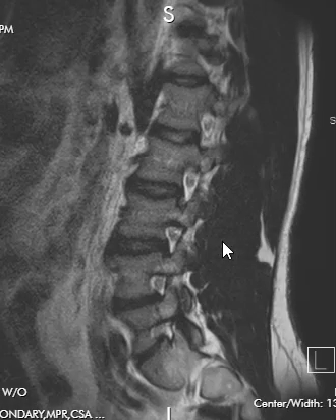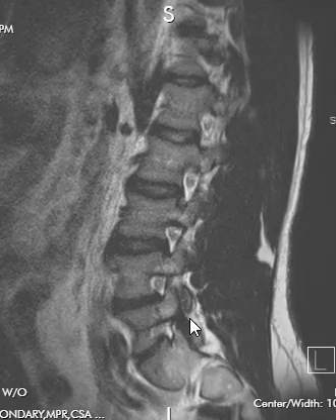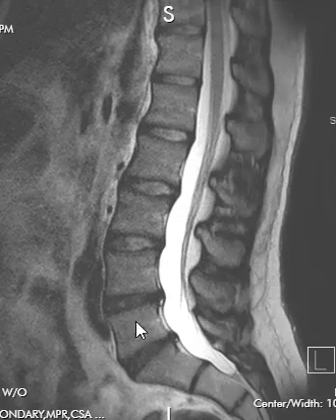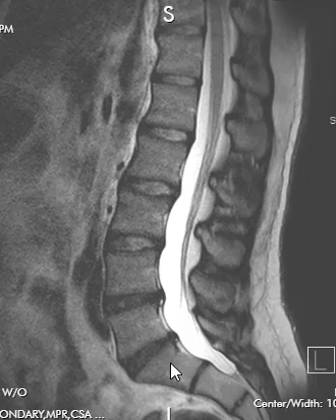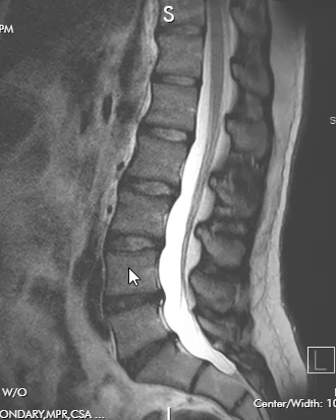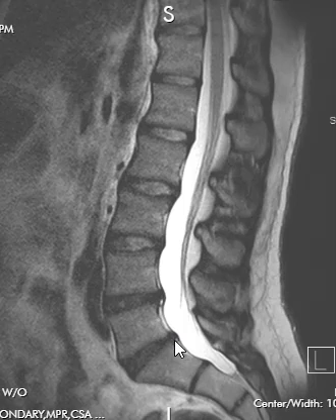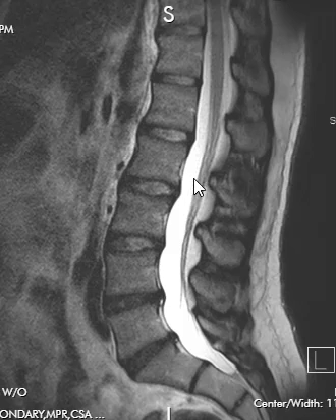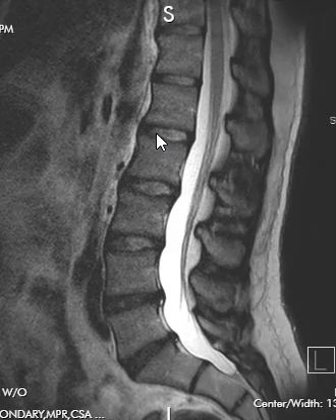This patient does have some narrowing at the very bottom level. We see L5-S1 down here, and there's a disc protrusion at the level above — L4-5 — and then at L5-S1 another little protrusion.